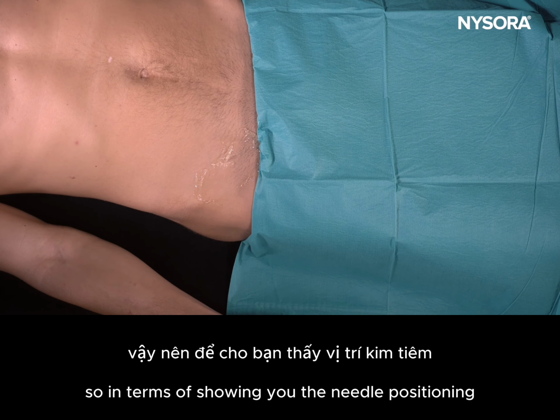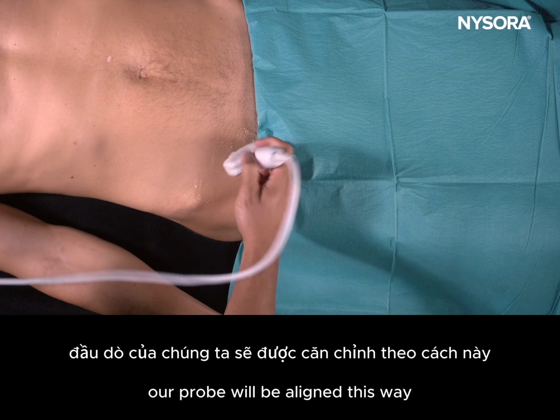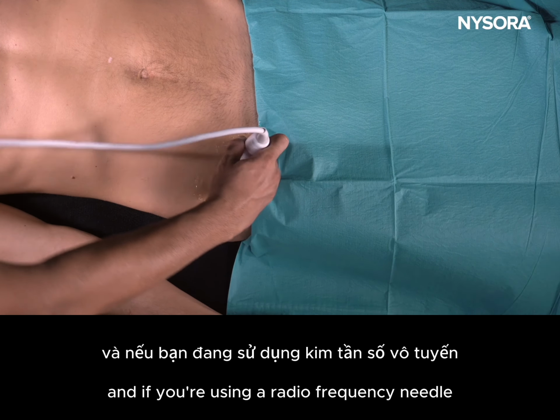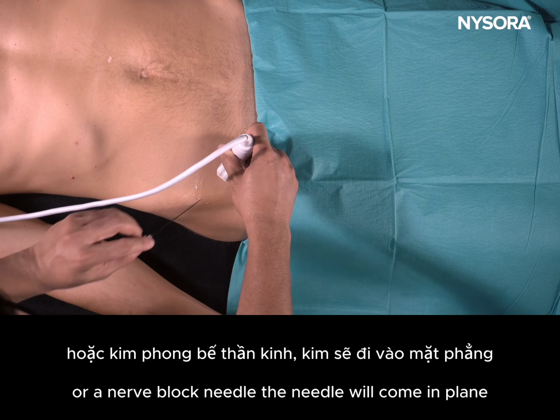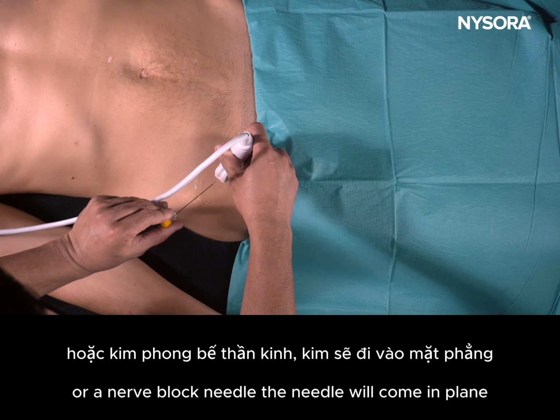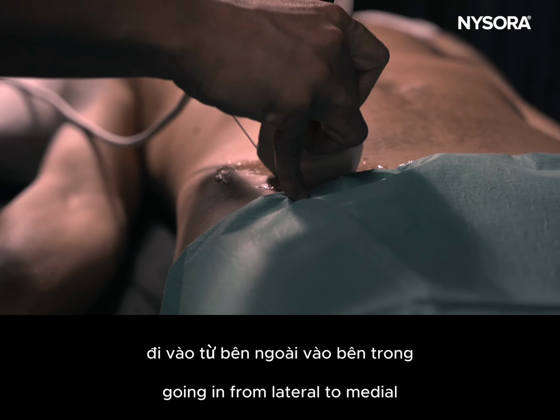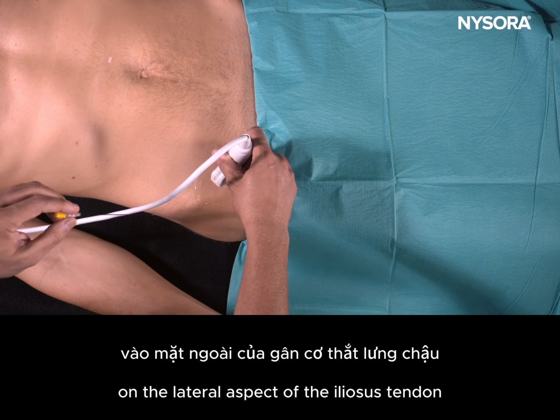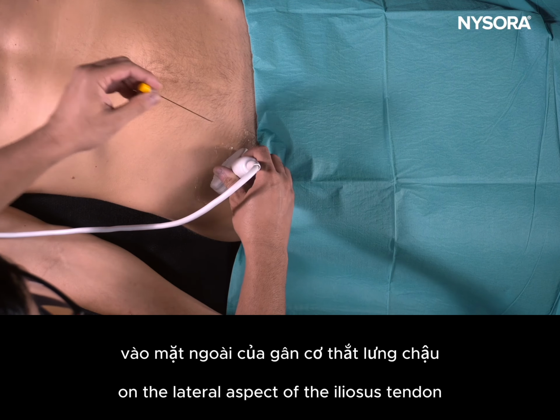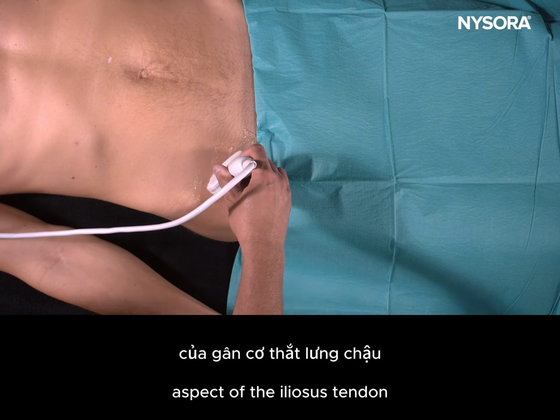In terms of showing you the needle positioning, our probe will be aligned this way, and if you're using a radiofrequency needle or a nerve block needle, the needle will come in plane, going from lateral to medial, and you will be depositing some local anesthetic on the lateral aspect of the iliopsoas tendon and some local anesthetic on the medial aspect of the iliopsoas tendon.